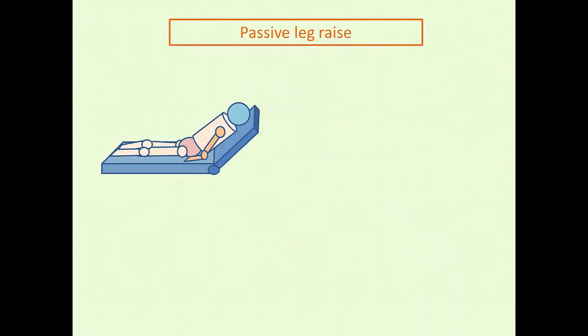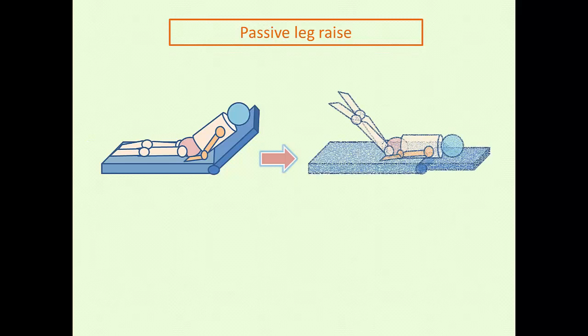So for the passive leg raise, the patient should be in a semi-recumbent position. You then lay them flat and then also at the same time raise the legs, and you should do this and measure instantaneous cardiac output by descending Doppler flow. Pulse pressure variation and stroke volume variation have not been proven to be adequate when doing the passive leg raise. You actually need some form of Doppler flow, whether a transthoracic aortic outflow VTI or a descending aortic esophageal Doppler, doesn't matter. But those will work in the patient who's making inspiratory efforts.